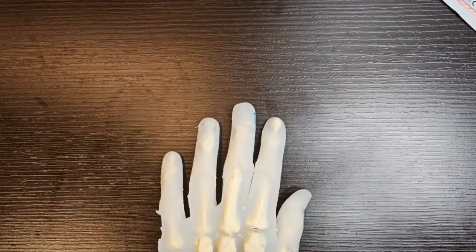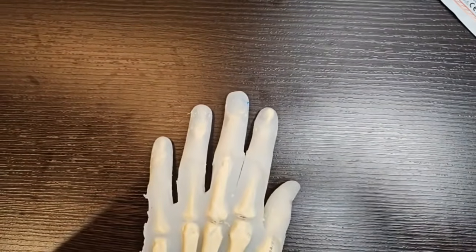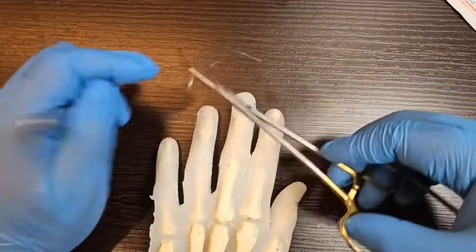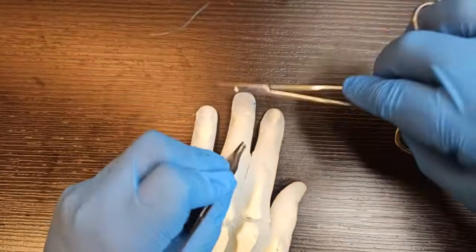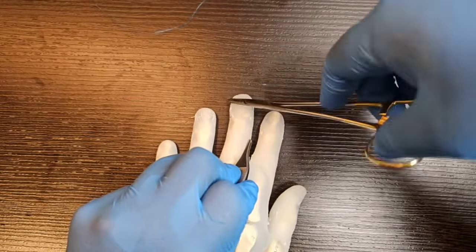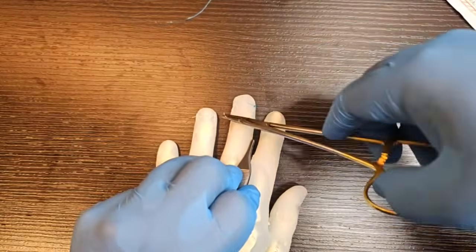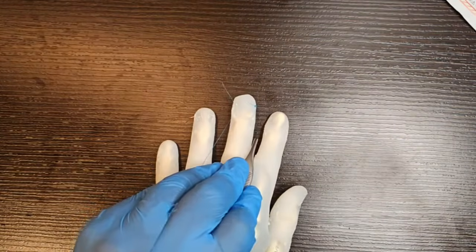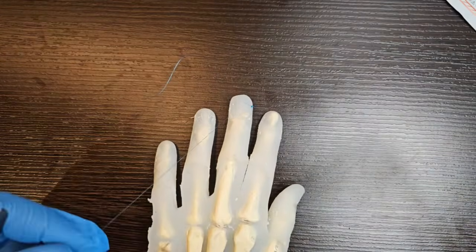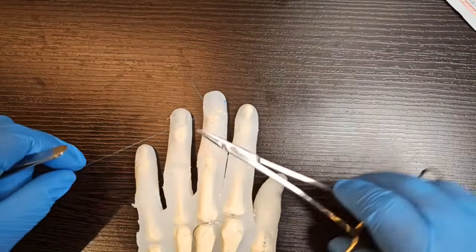So you now need to do the remainder of the pulp injury. And that's a bit over here. Again, you suture from island to shore, so that you're pushing unstable into stable rather than pulling stable into unstable and potentially pulling off the tip or the skin graft.